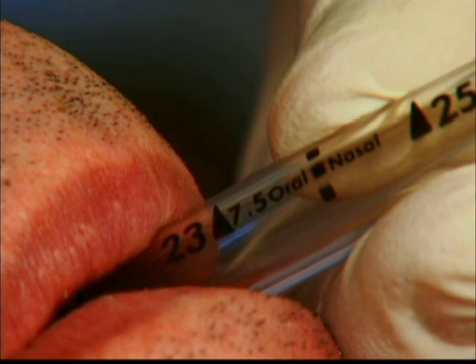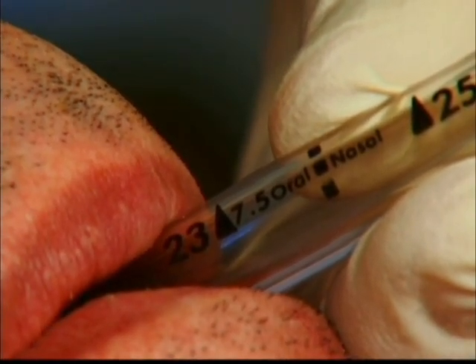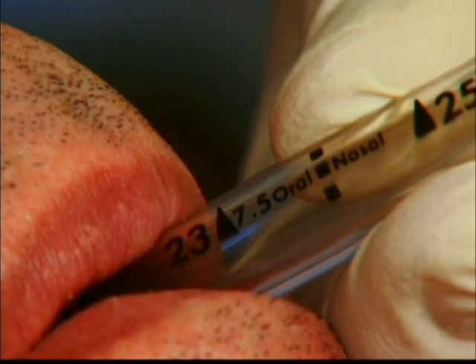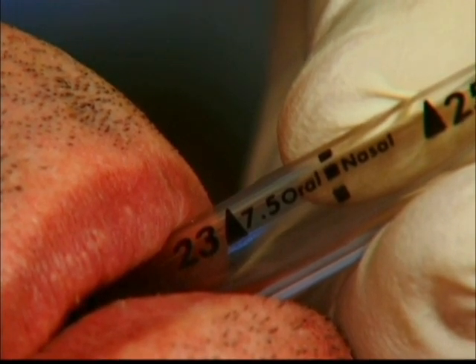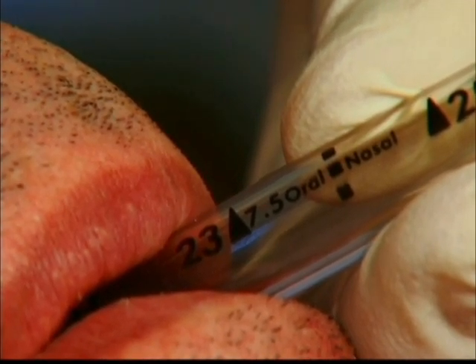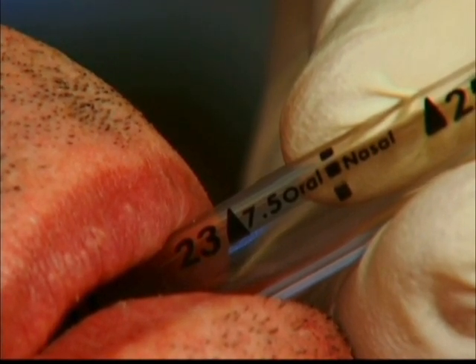Prior to bagging, note the depth to which the endotracheal tube is placed by checking the centimeter markings on the side of the tube. Note the centimeter marking nearest to the closest anatomical landmark, such as the nares for nasal tubes or the lips for oral tubes. The tube should remain at that depth at all times unless otherwise specified by a physician. Many patients are awake during this procedure, but whether you suspect the patient is conscious or not, explain to the patient that you will be taking them off the breathing machine for a short period of time, and reassure them that you will provide enough air with the bag.